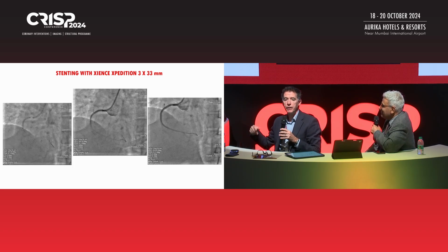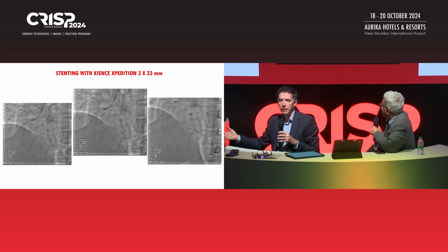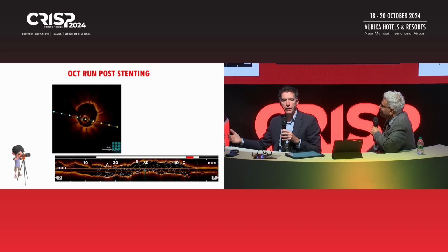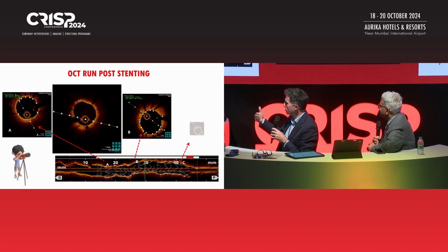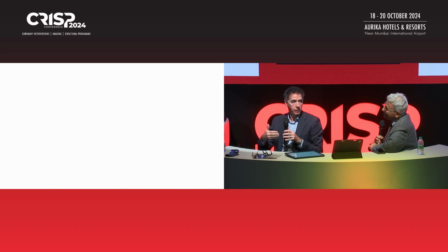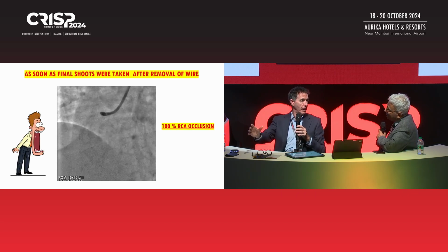And this is the angiogram with the wire, sir, after stenting. So you're done. The ostium looks fine, and then you take the wire out and do another angiogram. And you're just lucky that you had the stent in place, because that hydraulic dissection has gone down and hit the stent and stopped. So one of the things you can do if you've got a dissected vessel, some people put a stent down distally like a stopgap.